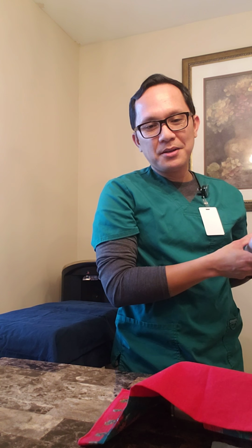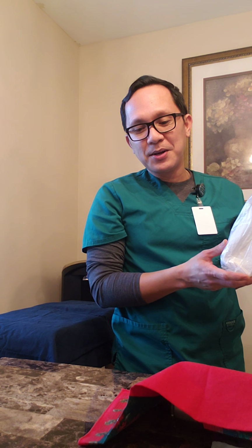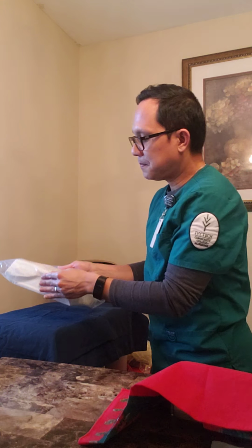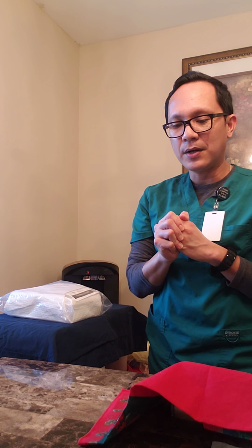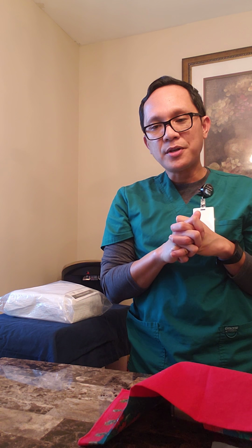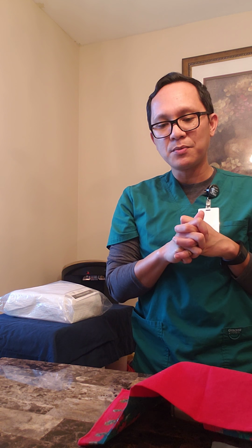Hi, Mrs. Smith. How are you feeling today? Okay, I'm back. So I'm going to be doing the Foley insertion for you today. I'm just going to put the Foley kit on the table beside her bed, close to Mrs. Smith's bed. Mrs. Smith, before we proceed, I just want to ask you if you have any allergies to latex. No. How about any other allergies or environmental allergies? No. You said you haven't had a Foley before, right? Okay. I want to make sure we make it as comfortable as we can.